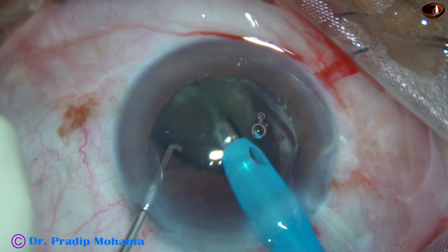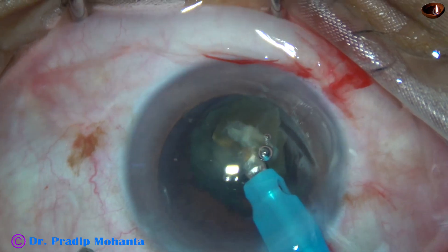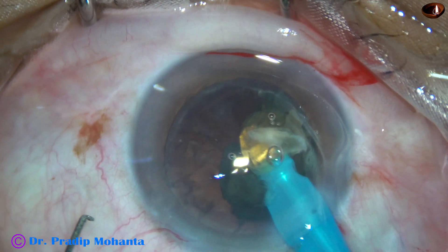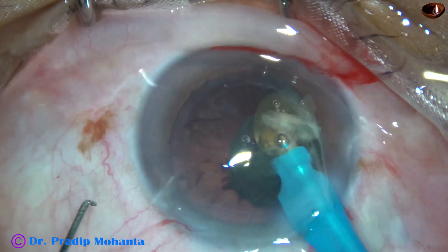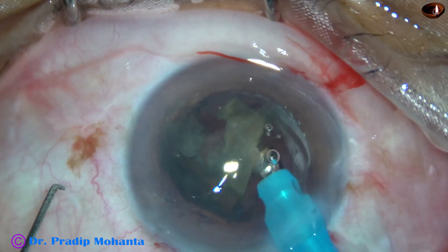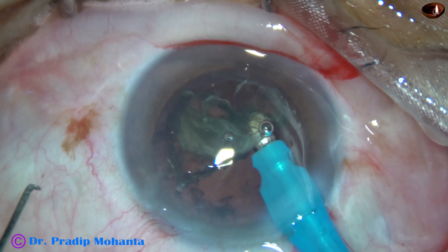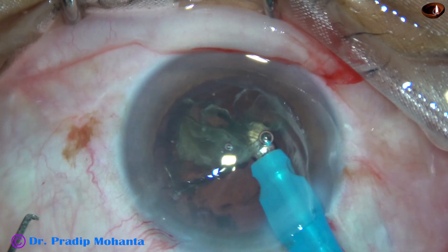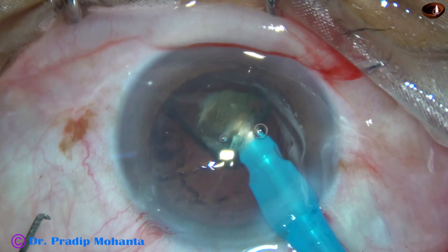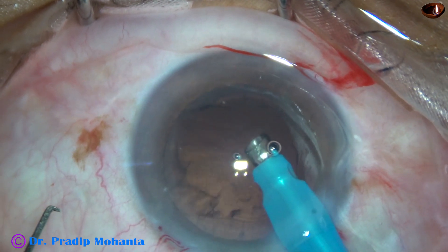Now see the emulsification of the last piece. At this time, the video is in slow motion, 50% of real speed. Here, there is hard material in front above, and soft material behind. This is dangerous, particularly if the anterior chamber stability is not very good. This can cause something wrong — and something wrong probably has happened. I am not sure whether something has happened or not, but yes, something wrong has happened. However, emulsification is done.